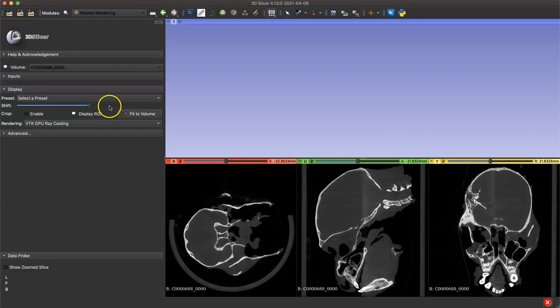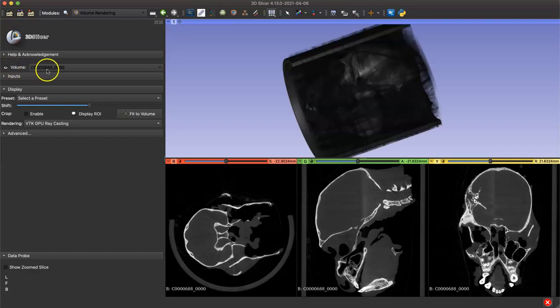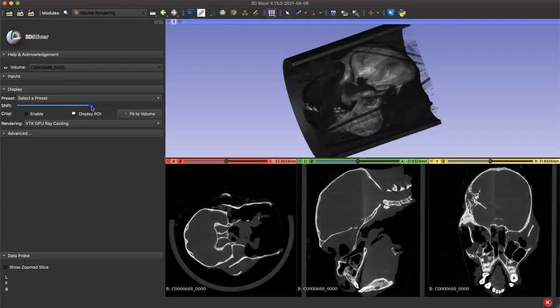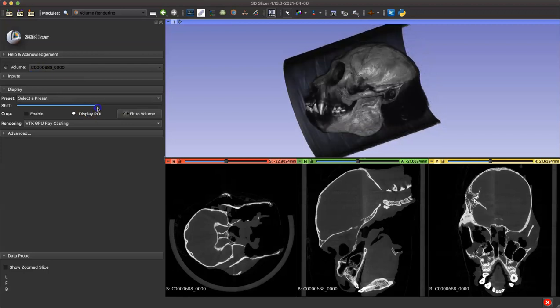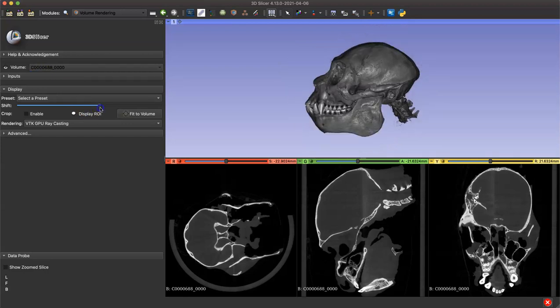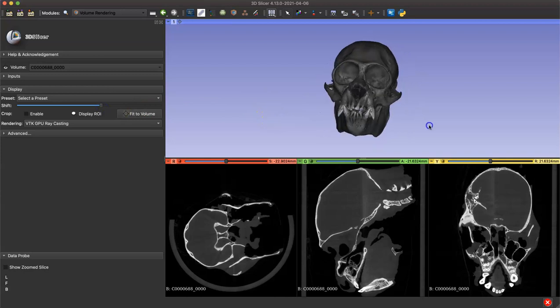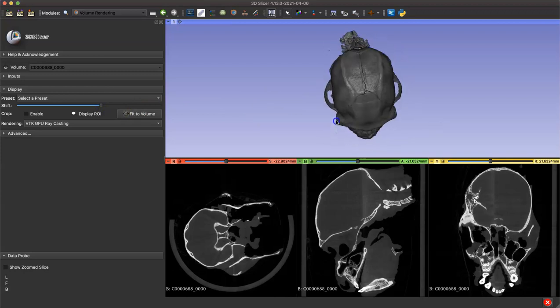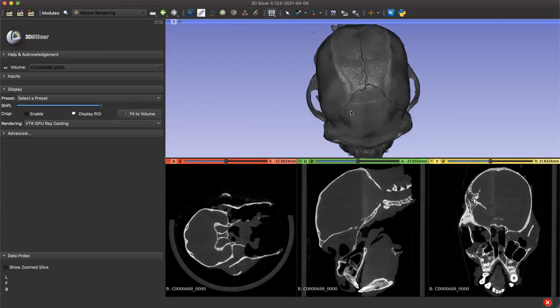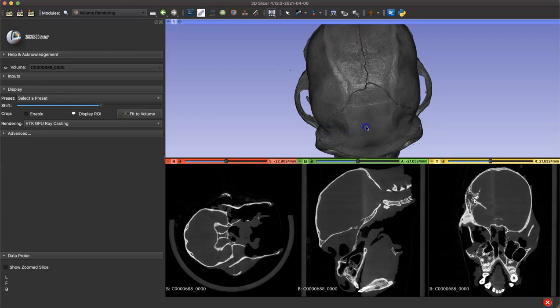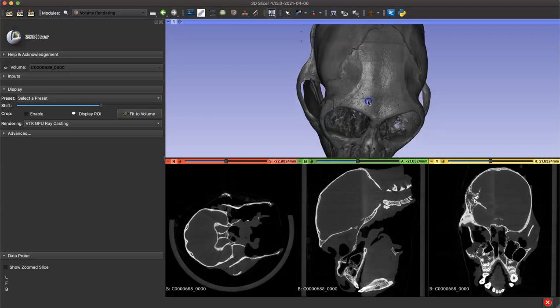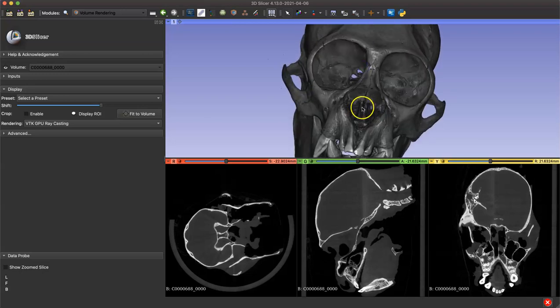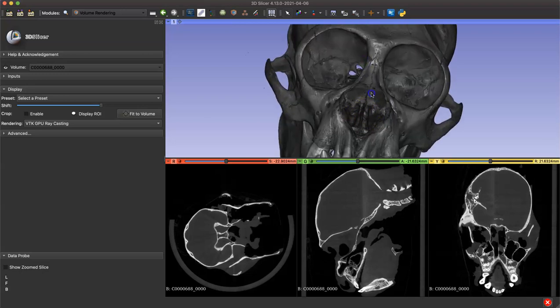Now I need to turn on the visibility of my model and double check that my volume is selected. Then we'll use that shift bar to isolate the material that I want to place landmarks in. In this case it's a primate skull. Now we can see the fine details of foramina and sutures that weren't as clear on the model, and this is really going to help us place our landmarks more precisely.